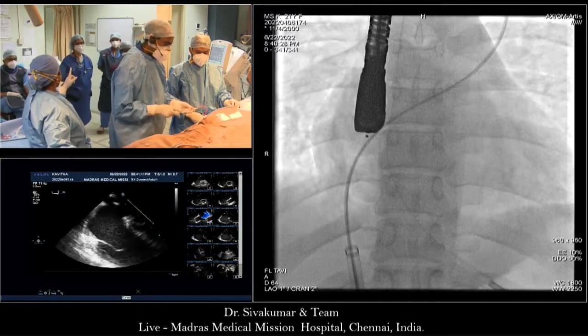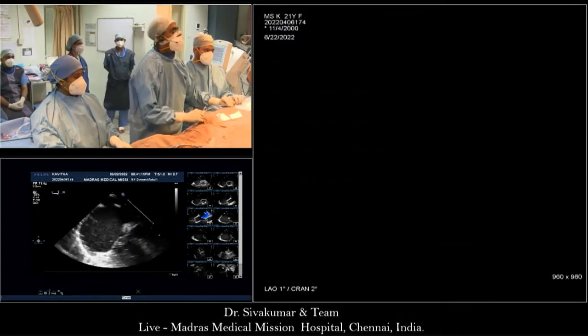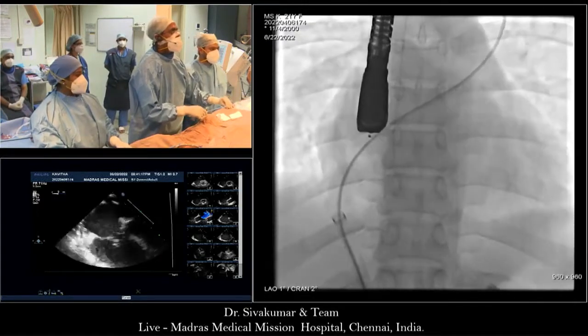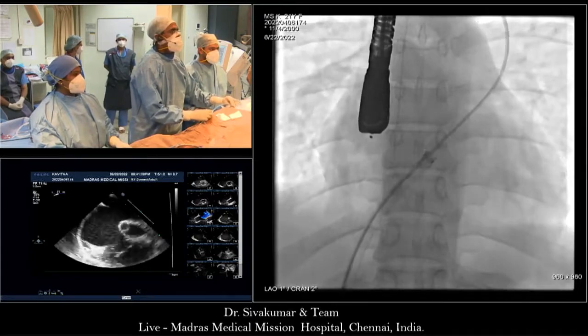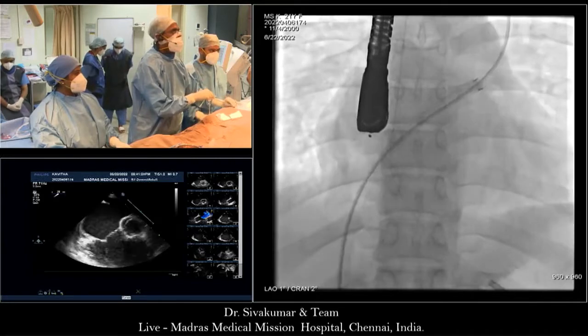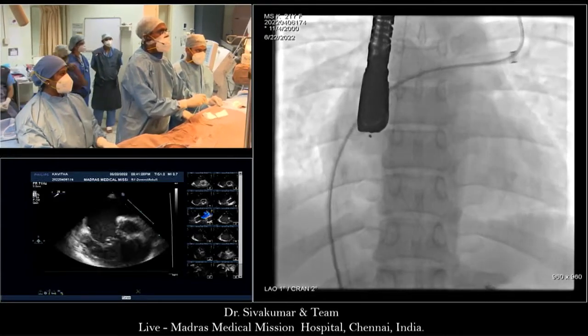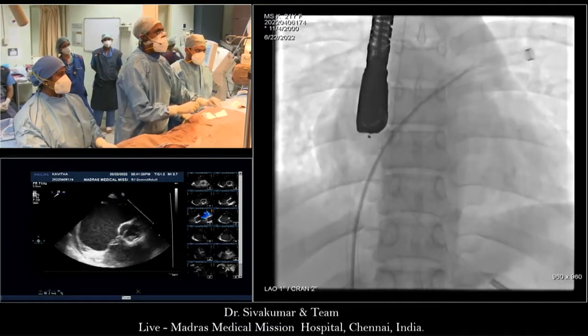Zahid. It should be there. Yeah. I mean, it's got to touch the aorta somehow. The waist should be touched. The whole idea is the device is going to splay, and we want that on the aorta. Yes. We don't want the waist touching. Right. He's taken the device out now.